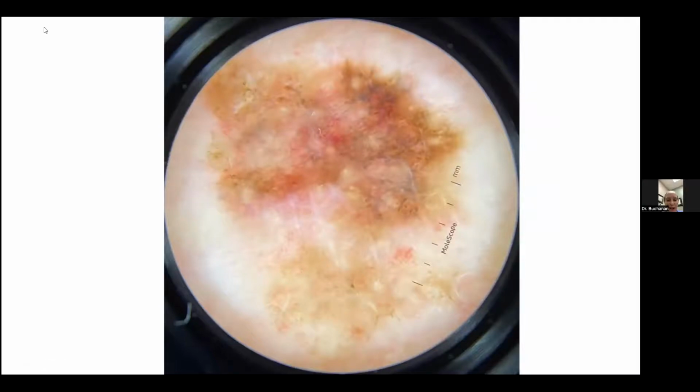So it looks like an atypical pigment network. You also see what looks like vessels as dots or perhaps linear irregular vessels. You also see some gray dots granules, which would indicate possible regression structures.